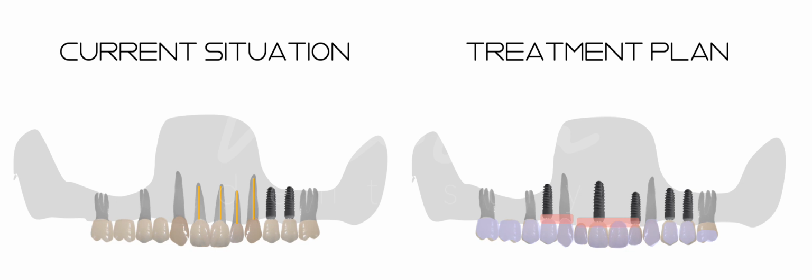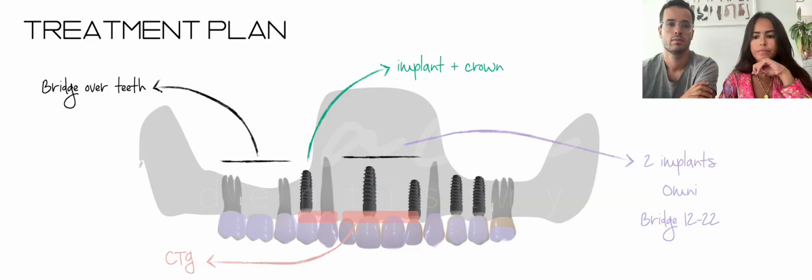In this case, especially because of the missing lateral incisor, careful planning was of great importance for the final aesthetic outcome, and you'll see later that without it, it would have been impossible to have the results we ended up having. So after a proper clinical and radiographic evaluation, we concluded that the incisors were already very fragile, with a history of multiple restorative and endodontic treatments, and with a very questionable prognosis. And that's why we finally decided to extract and replace them with dental implants.